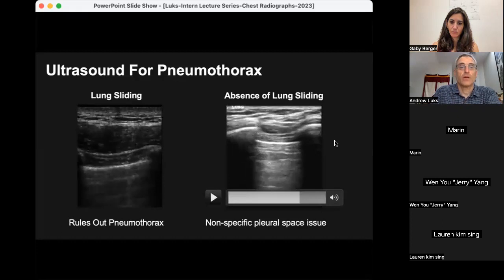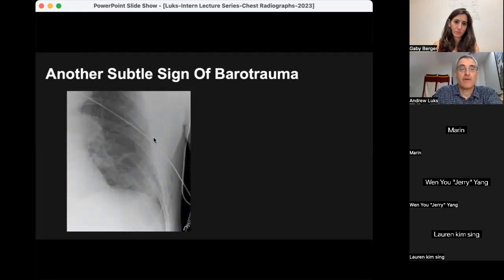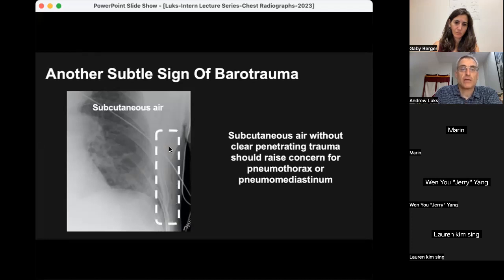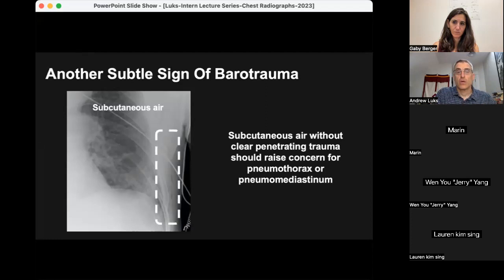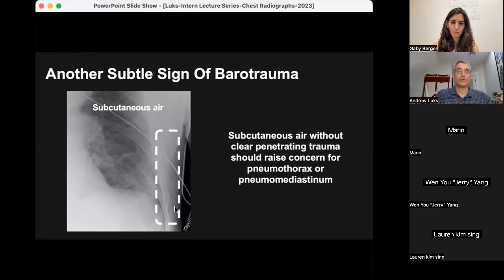There are other subtle signs of barotrauma you should be aware of. Here is a cone-down view of a patient's chest showing areas of lucency within the soft tissue — subcutaneous air. If you ever see subcutaneous air without clear penetrating trauma (the person wasn't stabbed, you didn't just perform a procedure in that area), that is usually a pneumothorax or pneumomediastinum until proven otherwise. Even if there's no obvious pneumothorax on the film, the presence of subcutaneous air tells you to look further.